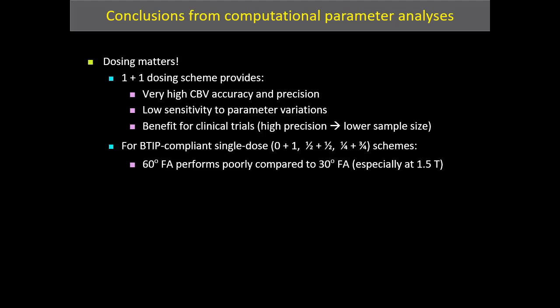So we concluded from these analyses that contrast agent dosing matters. Double dose contrast with a full dose preload provides high CBV accuracy and precision, low sensitivity to parameter variations, and may be beneficial in clinical trials.